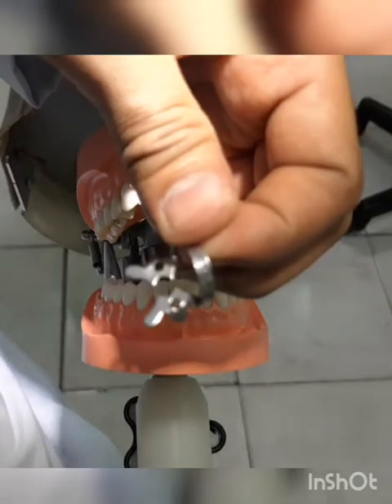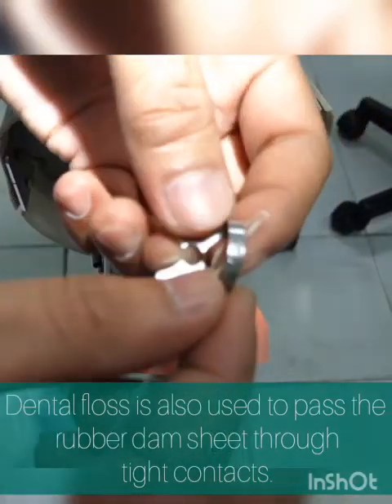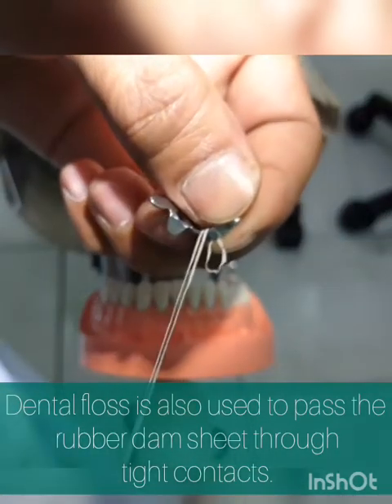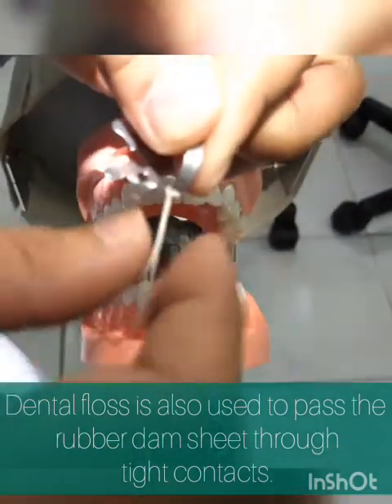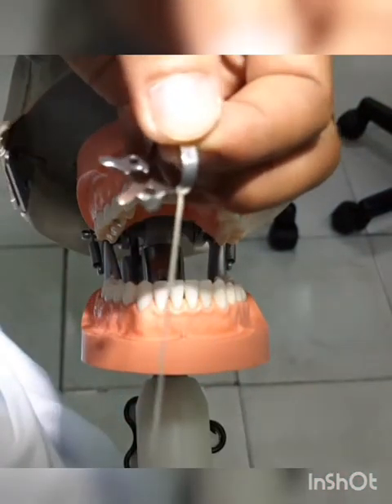Next, secure the clamp by placing dental floss. This is to prevent the clamp from aspiration when it's accidentally removed from the tooth surface. That's how you secure the clamp using your dental floss.